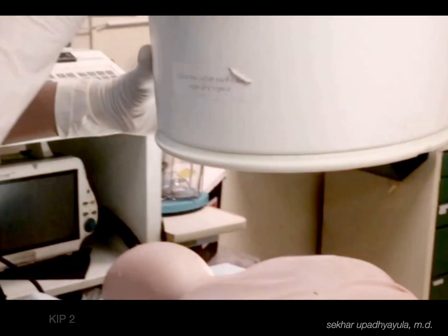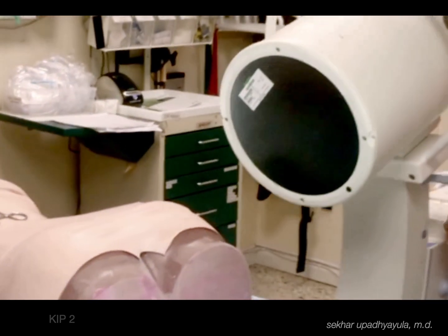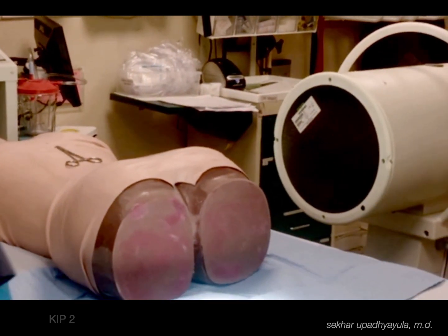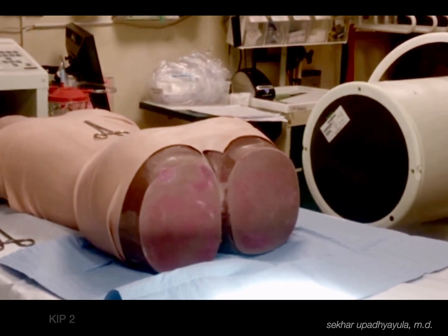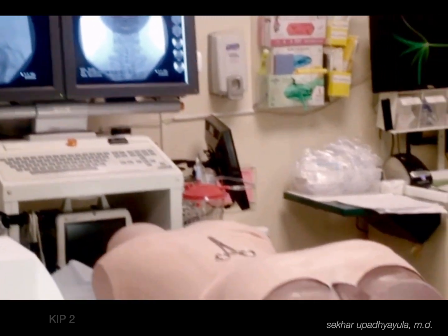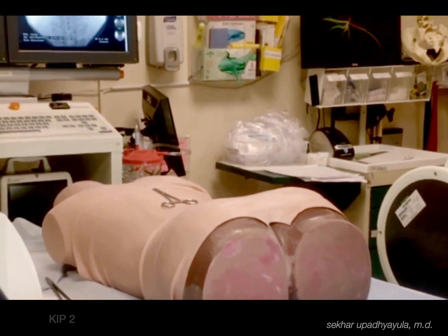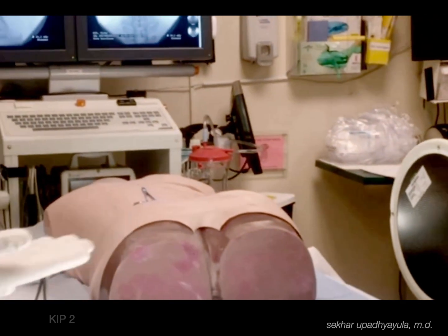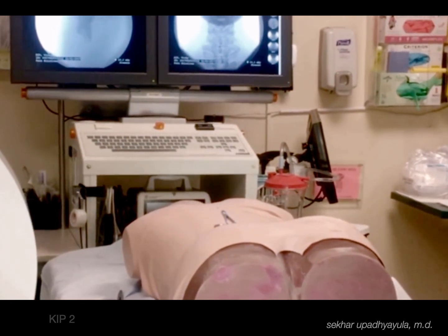Down. We'll do the same thing looking at lateral views. So if I was to get a lateral view, too high. Let's see. Can you shoot a picture from there? We need to raise your C-arm. I'll keep going. Higher. A little higher. That's it. Let's have a picture there. Okay. Let's get a nice clean image.